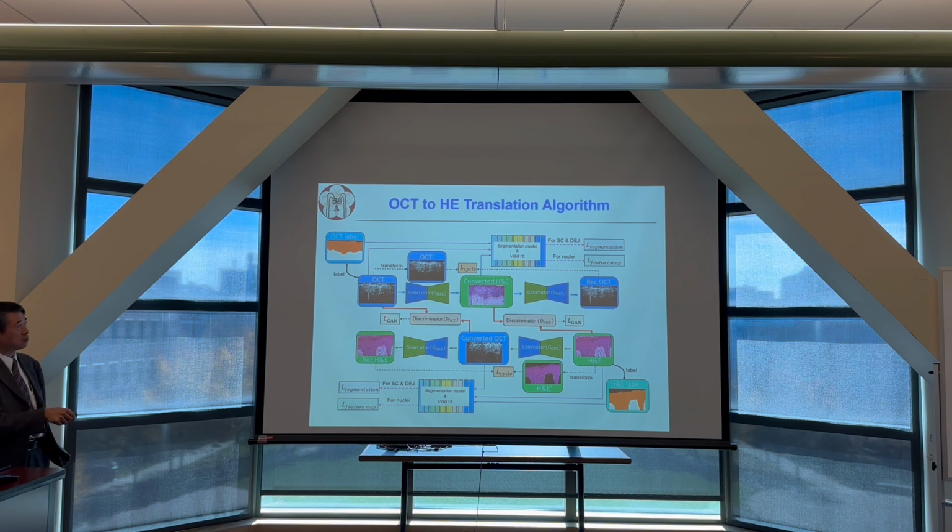So based on this CycleGAN, we try to add in physicians' knowledge. For example, remember we can segment out the dermal-epidermal junction, and we can segment out the nuclei.